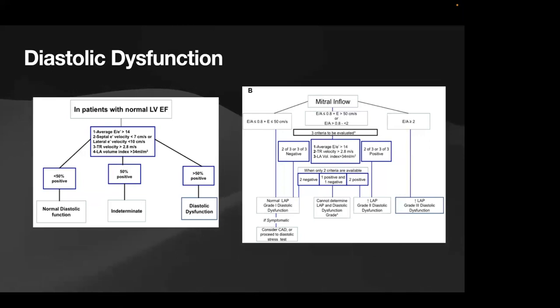So diastolic function, I guess the bigger picture is this. In diastolic function, this is straight out of the guidelines. We have your normal LVEF diastolic function on your left, and we have your mitral inflows on the right.